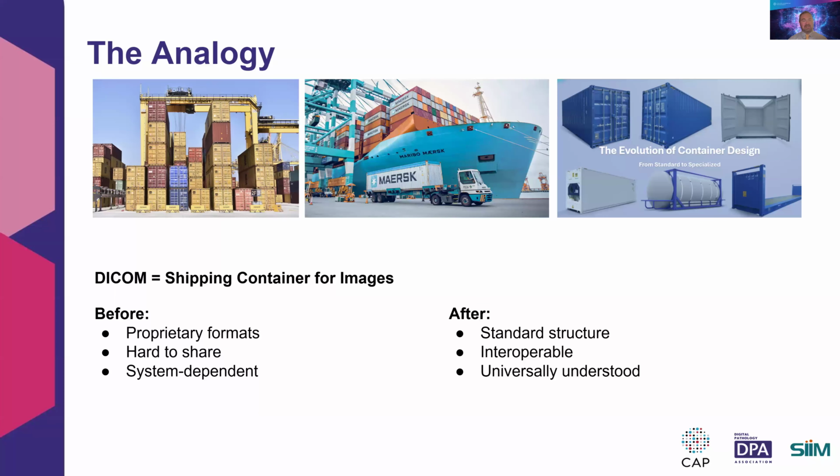It doesn't just carry the image, it carries patient information, acquisition details, device metadata, and the context needed to interpret the image. So in our case, it could be organ site, tissue type, the stains that were used, or IHCs. And so without that standardization, interpretation becomes extremely difficult.